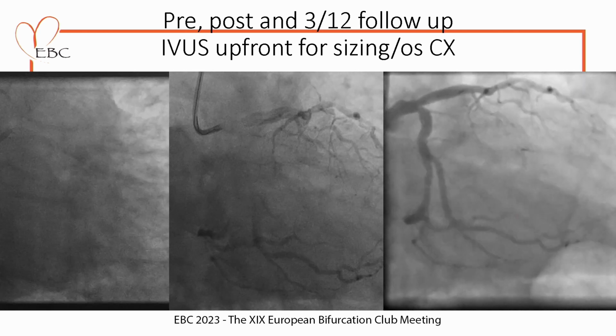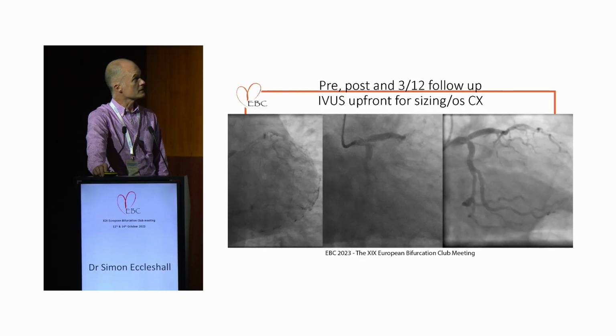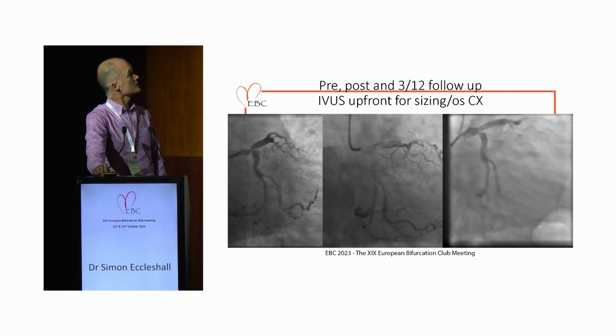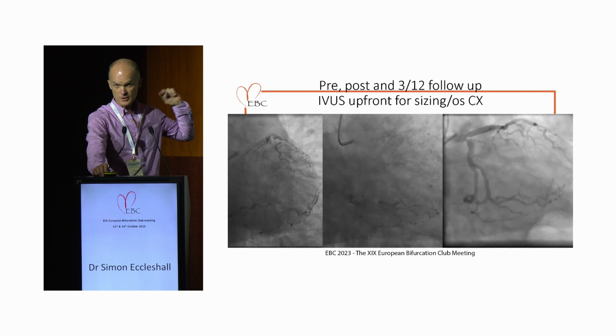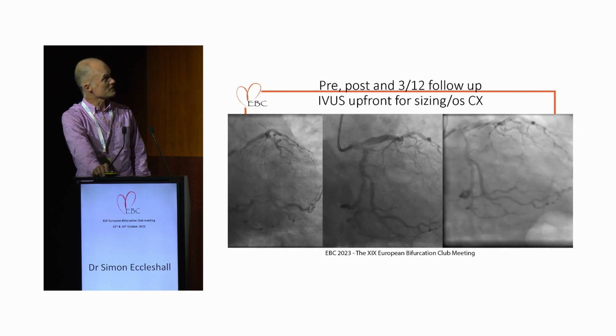So all we did was drug-coated balloon angioplasty, left main into LAD. Didn't need to treat the circumflex. So top left is pre. Hopefully you can spot that that's worse than the others. The middle one is immediately the end of the procedure.